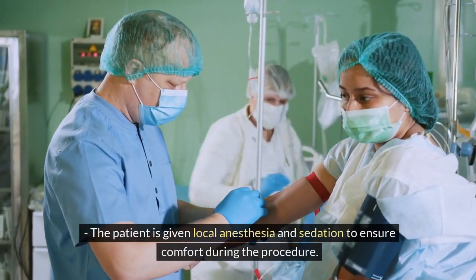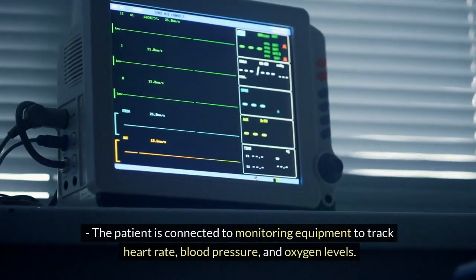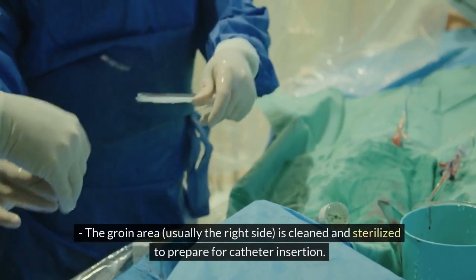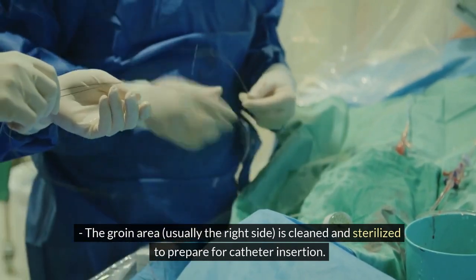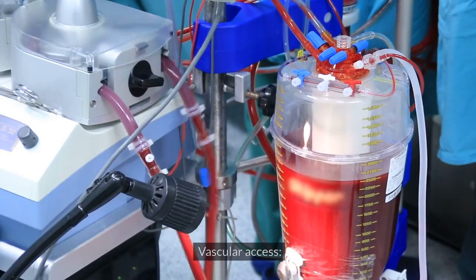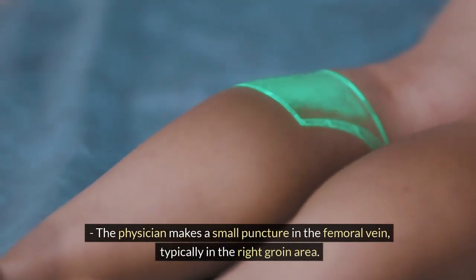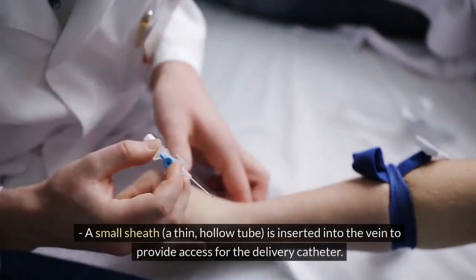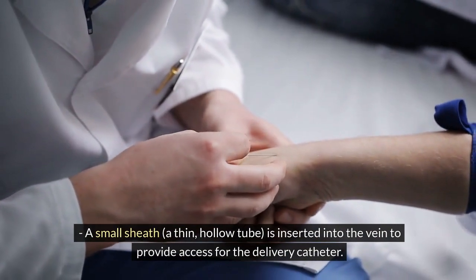The patient is connected to monitoring equipment to track heart rate, blood pressure, and oxygen levels. The groin area, usually the right side, is cleaned and sterilized to prepare for catheter insertion. Step 2: Vascular access — the physician makes a small puncture in the femoral vein, typically in the right groin area. A small sheath, a thin hollow tube, is inserted into the vein to provide access for the delivery catheter.